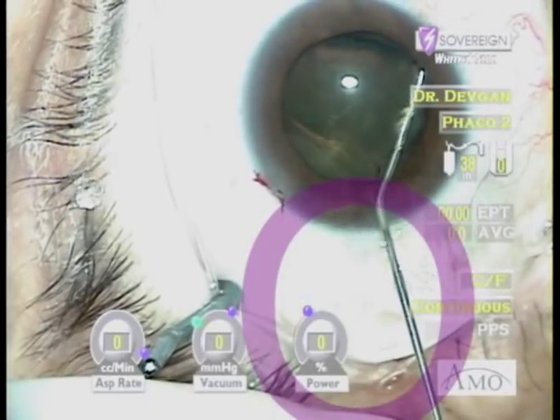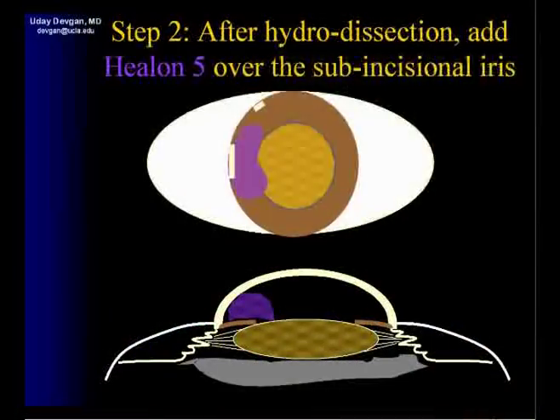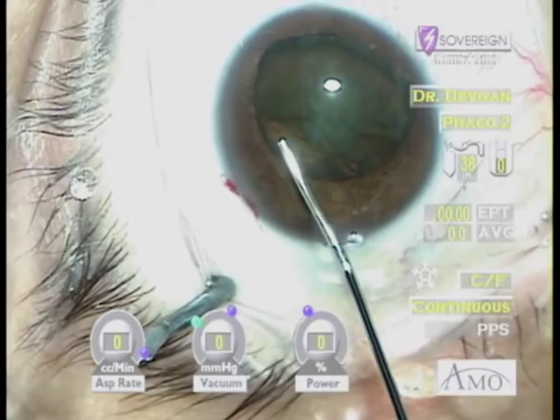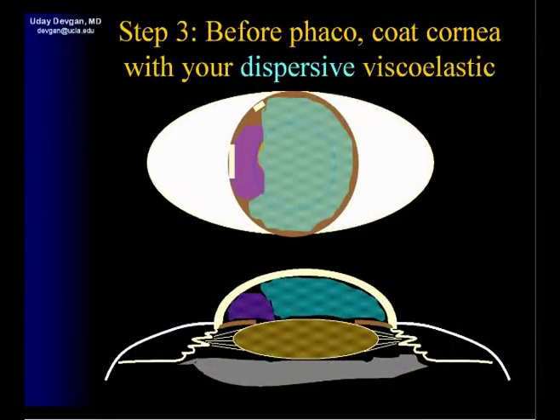During hydrodissection we lose some viscoelastic, therefore it's important that we replace this by adding more Helon 5 over the sub-incisional iris before FACO. Now we'll go ahead and add our traditional dispersive viscoelastic to coat the cornea.